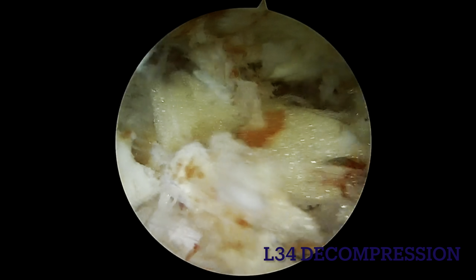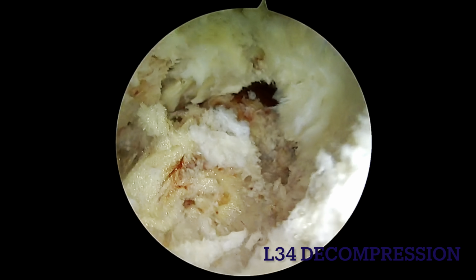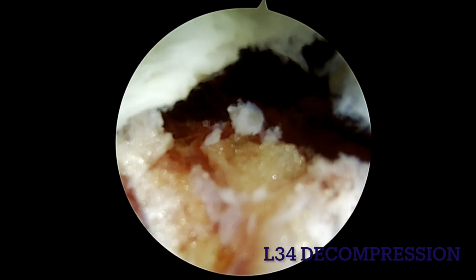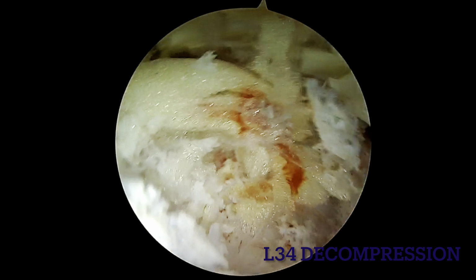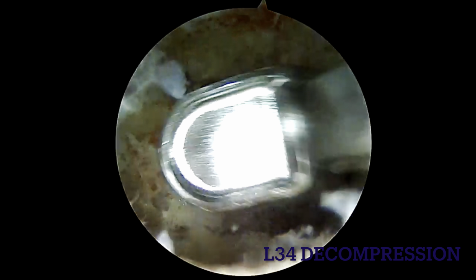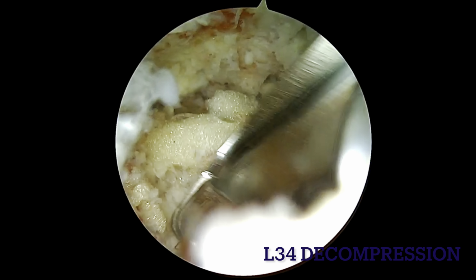we have decompressed the L3-4 level well with excision of ligamentum flavum. Now you can see, well seen, I have removed the lamina of the L3, and you can see inside from here the L4-5 level, which is well decompressed. So we have finally done a fusion at L4-5 with a decompression at L3-4 and L5-S1 level.